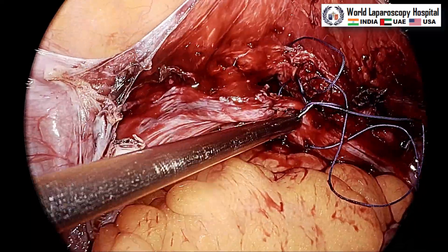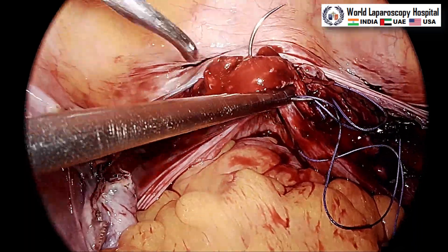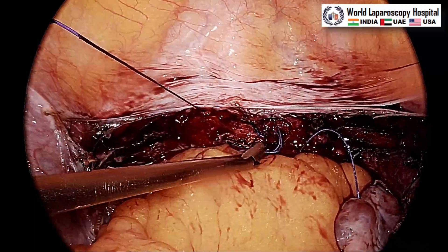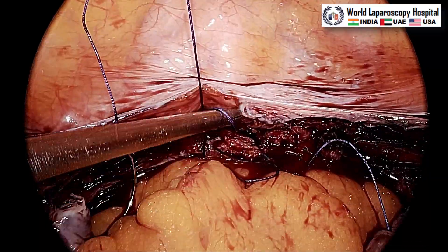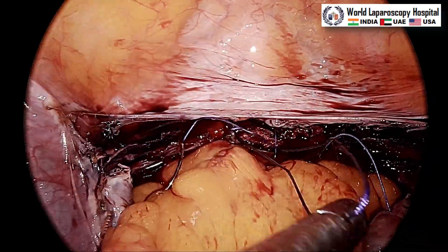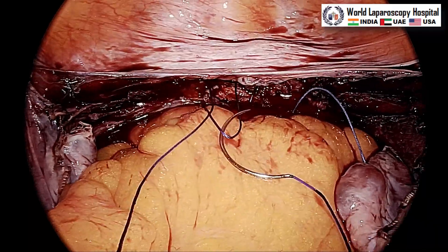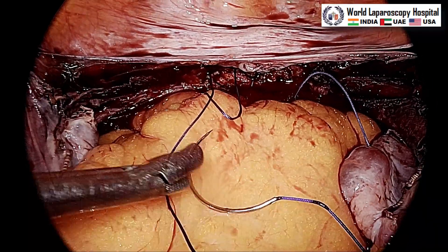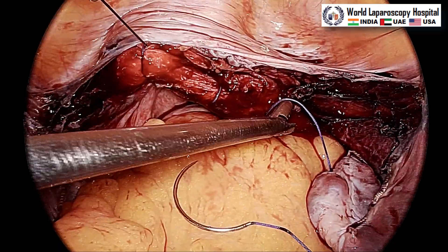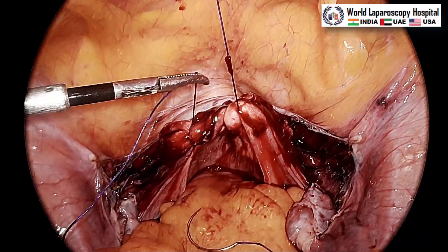If you have a four-port setup, the assistant can hold the UV fold and give anterior traction, but with three ports you have to do it yourself. Once you reach the other end, lock the suture — go through the loop, pull the suture out and it will interlock. Locking has the advantage that you can tighten the first row and then return back. We started from the right and have now reached the left where we locked the suture. After locking, hold with the left hand and use the right hand to catch the tail and slide the first layer, then start returning back.